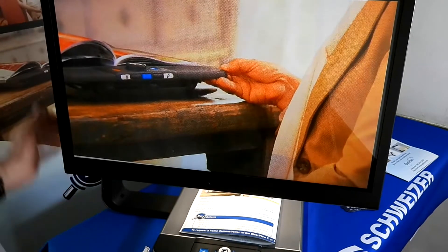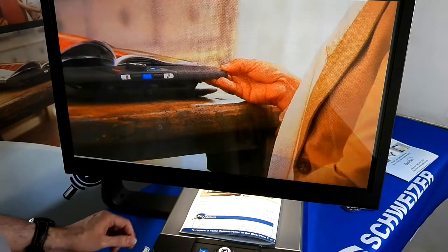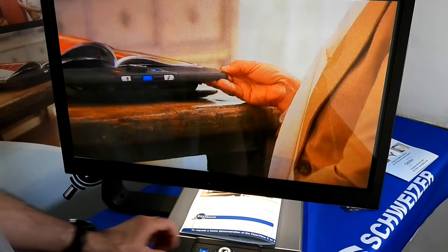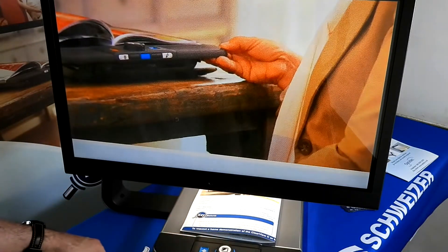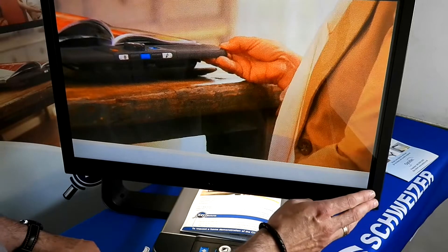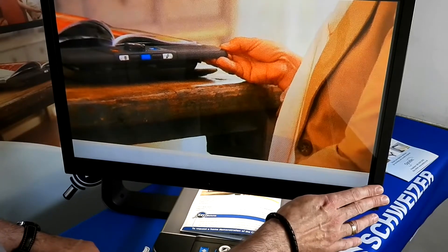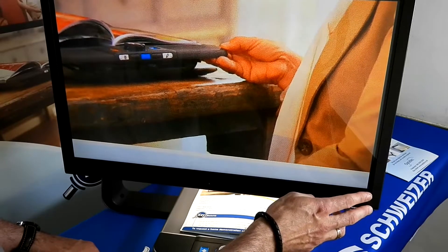Unlike the normal video magnification, the speech side is controlled via a touchscreen. This is a 24-inch touchscreen, and the way you activate it — once you turn the machine on, which is the standard way for all our Clearview C range by pressing on the power button, the raised orange dot circle — the machine will go through a series of beeps, then a musical note will play. Once the musical note plays, which usually takes about 40 seconds from boot because the software inside is booting up in the background, you can activate the touchscreen by just touching the bottom right-hand corner of the screen. People with sight loss can feel the bottom metal part of the frame of the monitor and just touch the glass slightly above it.